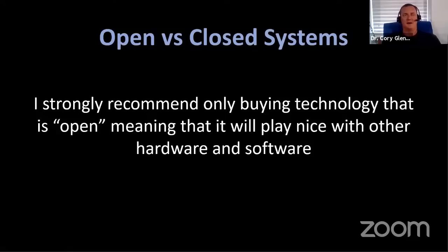as you get into this, you're obviously going to have a few things to be able to get started. You're going to have some way of generating models, right? If you're going to do printing, you're going to have some kind of printer. If you're going to do sintering, you've got to have some kind of oven. Okay, so there are all these components that come together if you're going to make these restorations in-house.